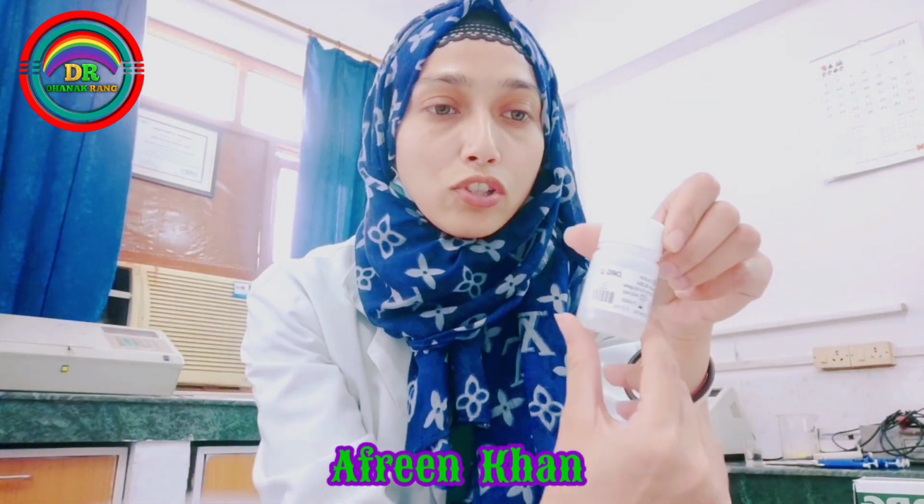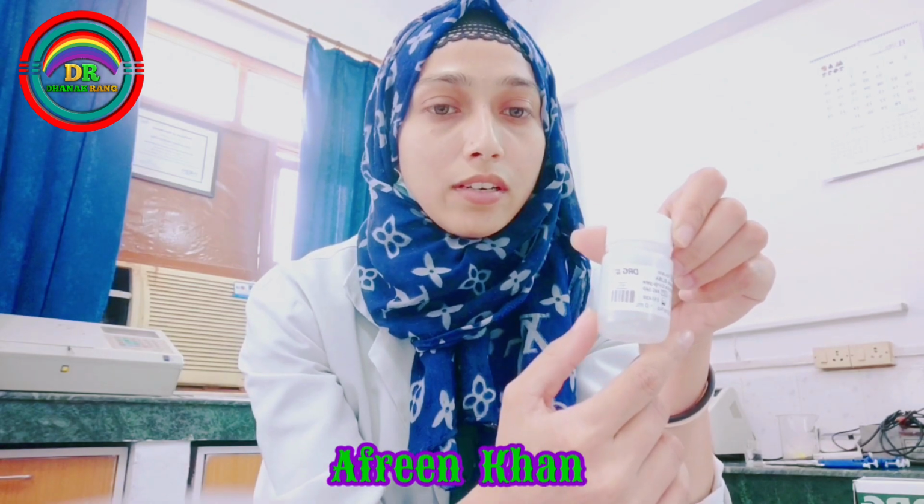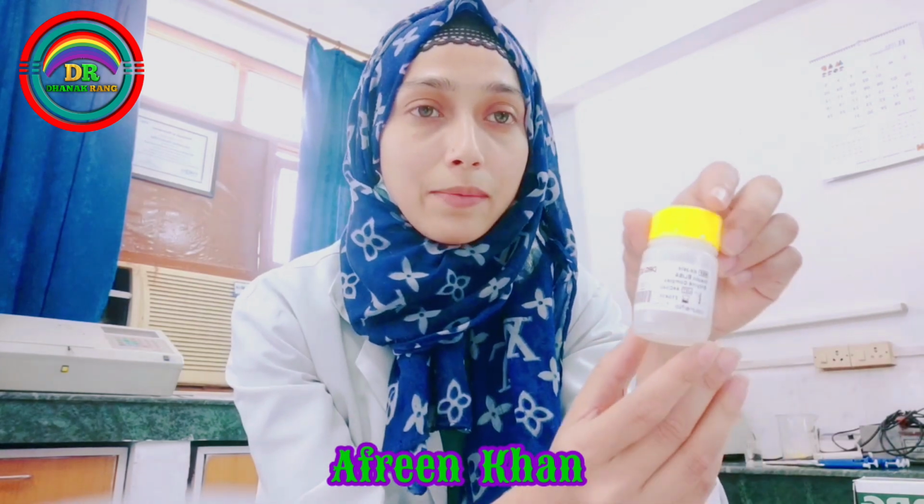So we have got this microtiter plate, which is coated with the monoclonal antibody directed towards the unique antigenic site on the insulin molecules. Then we have this enzyme conjugate, which is an anti-insulin antibody conjugated with biotin. And then we have the enzyme complex, which includes a secondary antibody, a streptavidin peroxidase enzyme complex, which binds with the biotin anti-insulin antibody. And we have this wash solution.